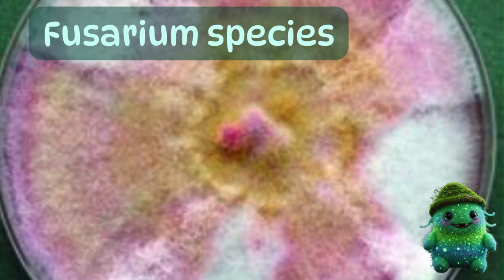Moving beyond the Aspergillus species, we have Fusarium species, which slides in at number 5 on our list. Known as a common cause of fungal eye infection called mycotic keratitis, Fusarium is also involved in other mycoses. Pretty in pink or purple is how the colony develops after starting out as cottony white.